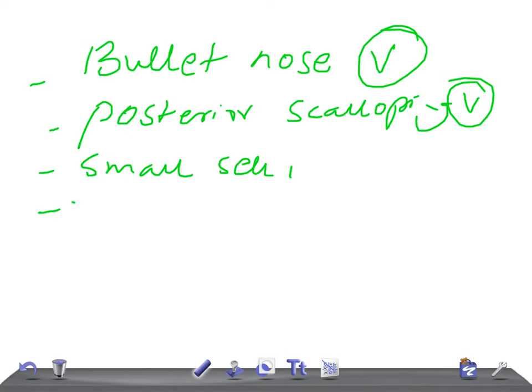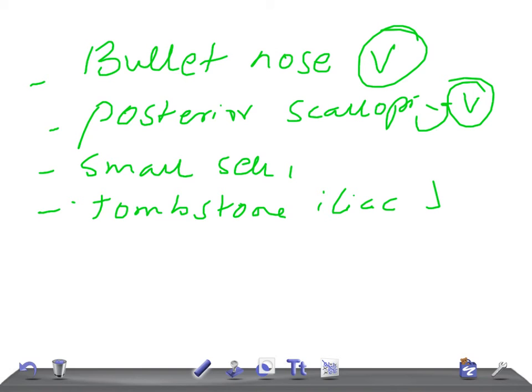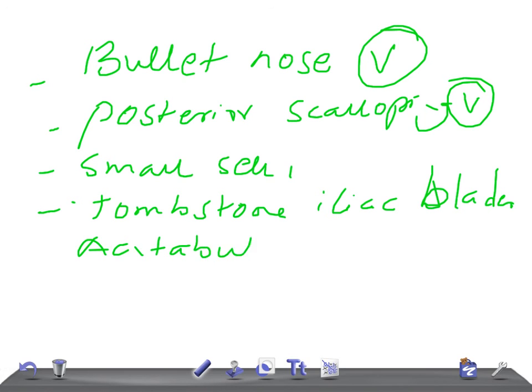And then tombstone iliac blades with posteriorly set acetabulum. So these are the radiological findings of Achondroplasia. Thank you so much for watching this video. Take care.